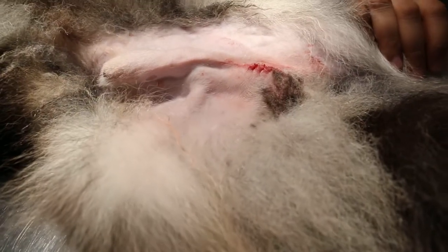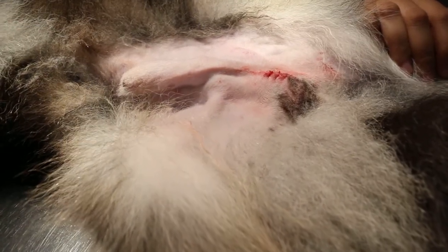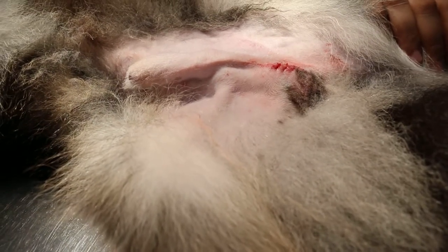24 February 2015. This video is to show how I neutered the Shetland, 7 months old, 5.6 kg, using injectable anesthetic.